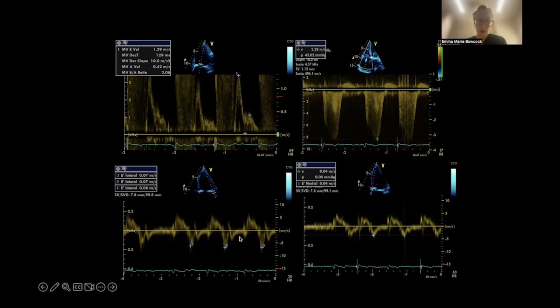Yeah, so I mean, we might be getting a few little P waves or some sort of atrial activity because we've got some sort of A wave here, but you see how it's irregular? The space between this and this is different to that. So I think she is in atrial fibrillation. So obviously we wouldn't get this classic sort of... Yeah.